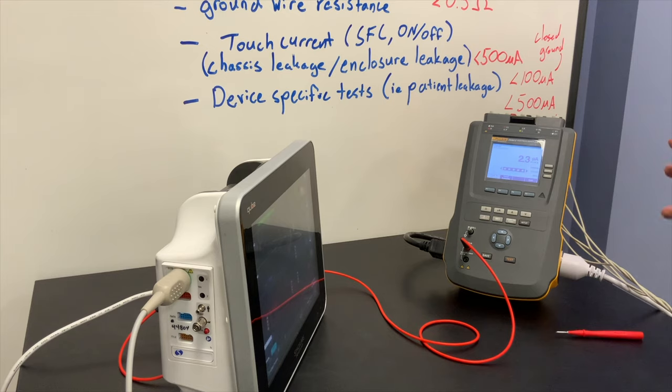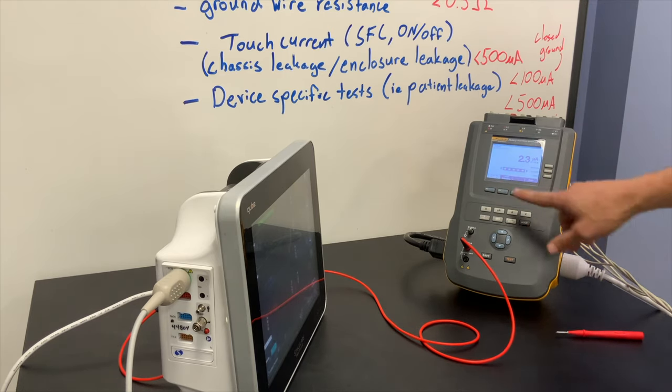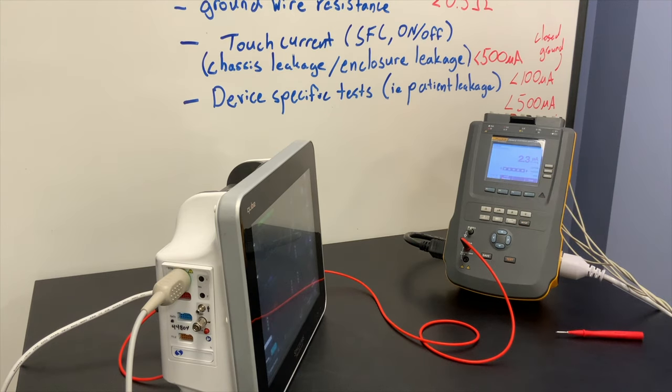You'll also see the lead isolation test here — that's a test not required in NFPA 99; it's a test you'll see in ISO standards. You do want to be careful about that test, as it energizes the leads at 120 volts just to make sure they stay isolated. If you were to touch those leads during that test, that can actually be dangerous.